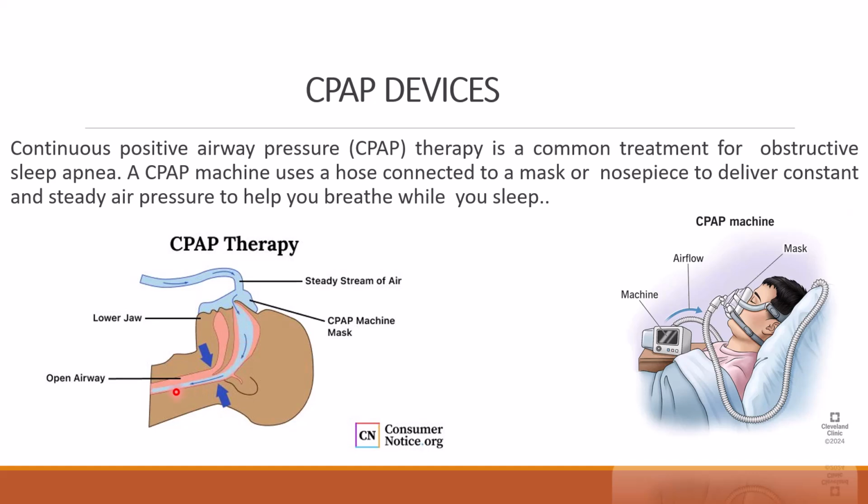And we are going to apply a pressure just to elevate this area. The applied pressure is determined by the doctor. Okay, this is the working principle of CPAP. And of course we have a compressor, and we have also a humidifier, and we have also the breathing circuit and the breathing mask. Maybe this one will not be too comfortable for some patients, but the doctor will decide it.